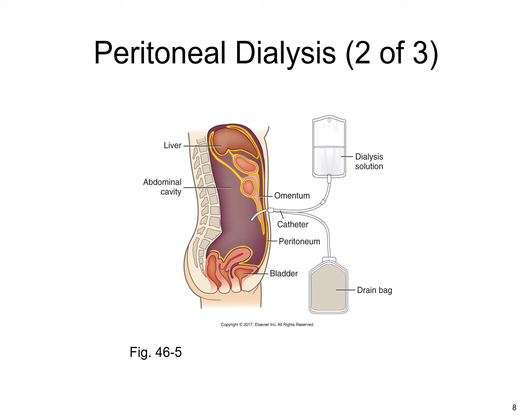So this is a picture of what peritoneal dialysis may look like. I do need you to be familiar with the bags and how they look, right? This is the dialysate solution that's coming in, and this is the catheter over here. It's going to have 2 ports. One is to receive the dialysis solution, and the other one is to drain the junk after they are done, right? Depending on the orders, maybe it's a 2-liter bag that you have to hang.